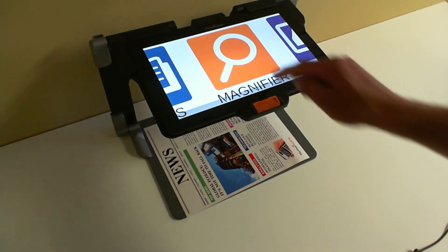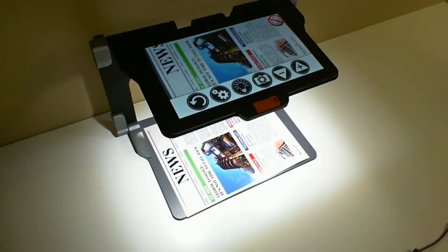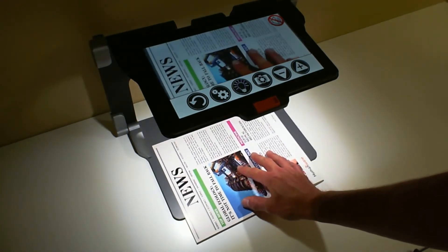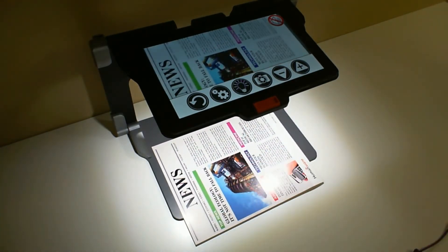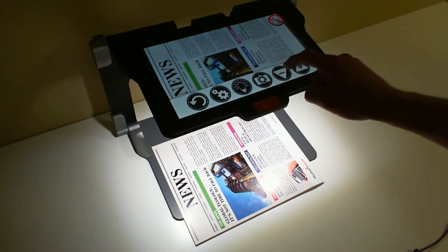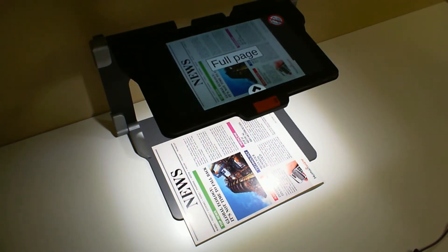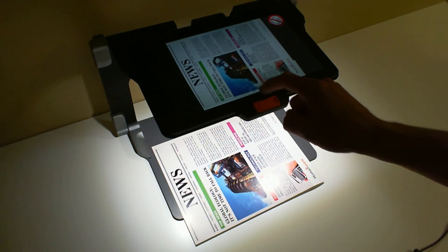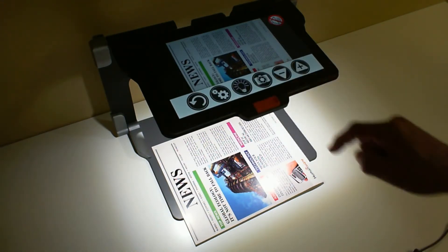To capture a document, you go inside Prodigy in the magnifier application. In my situation here, I would like to capture a full page which has been placed underneath my Connect 12. So I'm going to zoom out to have a full page, and to capture the document, in the button banner you click on the capture button.